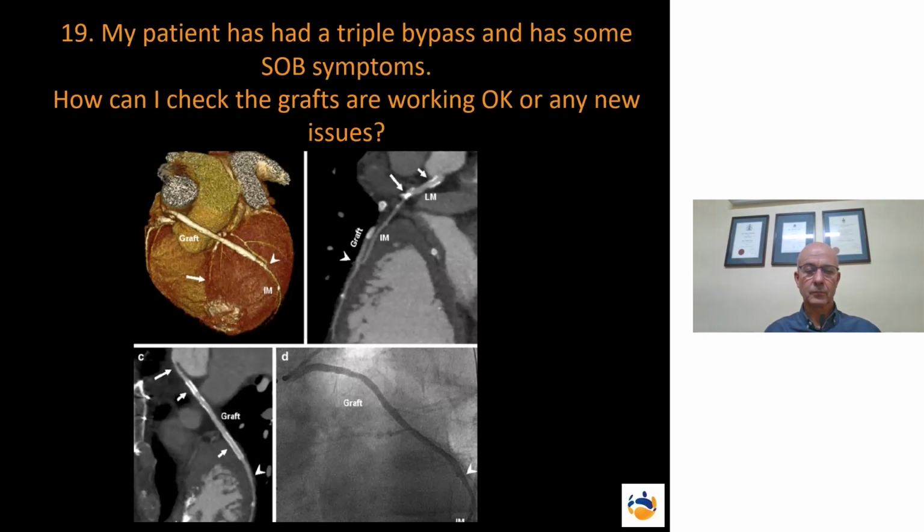So to look at a CABG, a coronary artery bypass graft, coronary artery CT is a superb way to do so, and I think it should be done much more frequently. But obviously, if the patient is developing symptoms, then you would do it. If they're not developing symptoms, probably not necessary to do it.